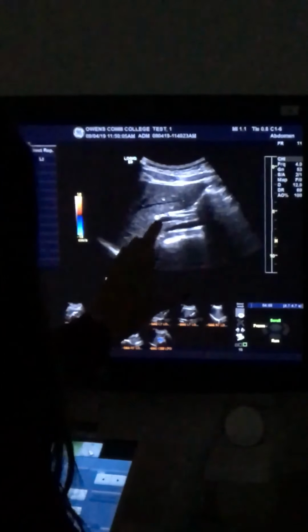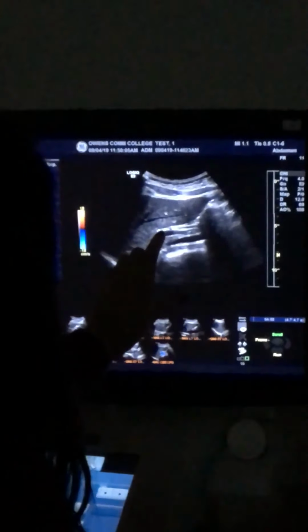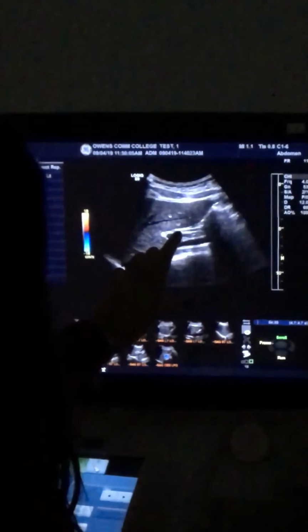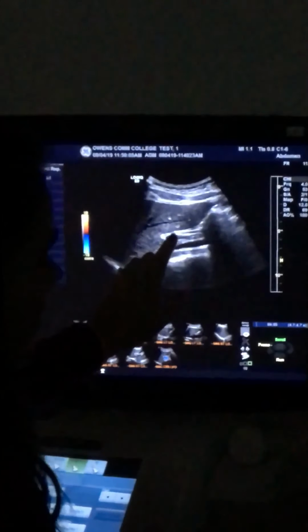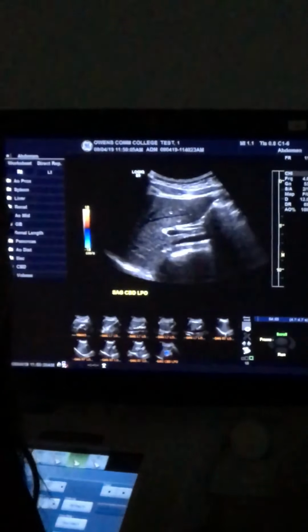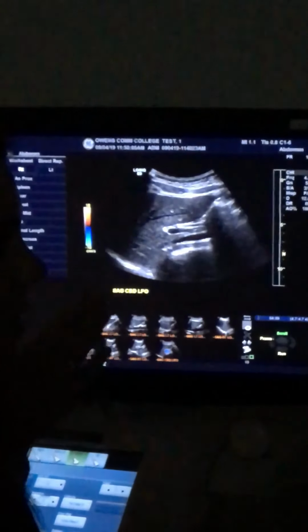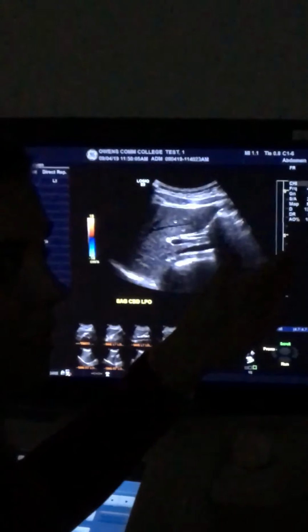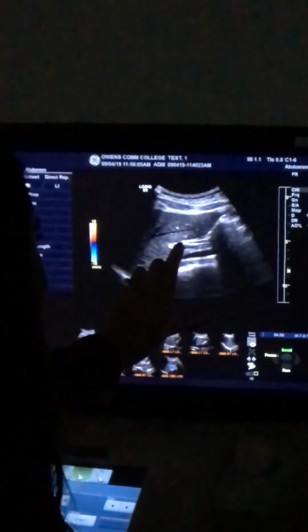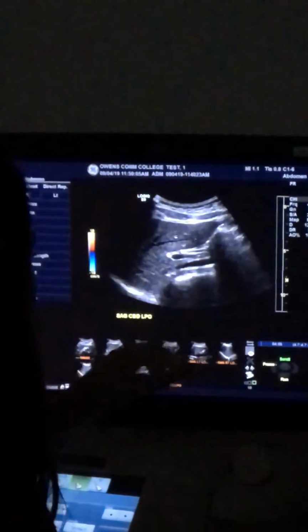And then this is the duct. So the duct actually starts here. This is considered hepatic duct. Crosses over the top of the hepatic artery, or sometimes under, just a normal variant on people. And then it becomes the common bile duct. It's like those streets where it's got one name and then you cross an intersection and suddenly it's a totally different name street, but still the same street. It's like this. So hepatic duct crosses over hepatic artery and becomes common bile duct.